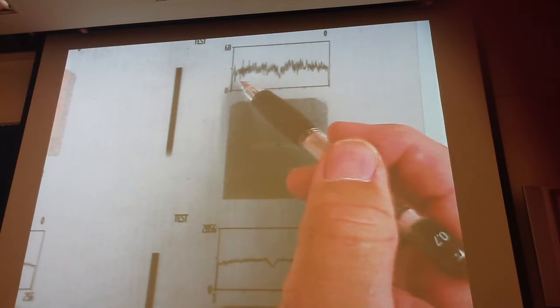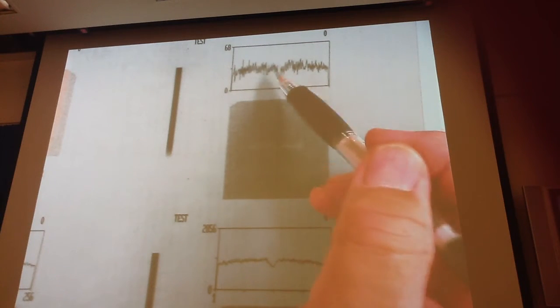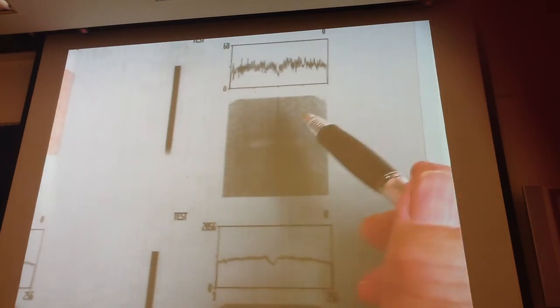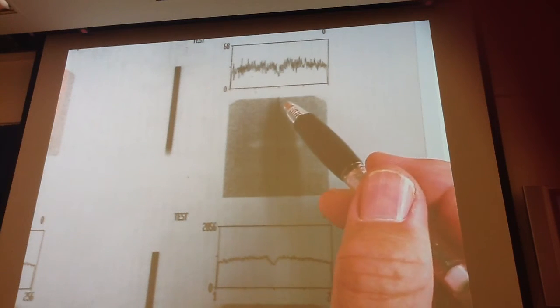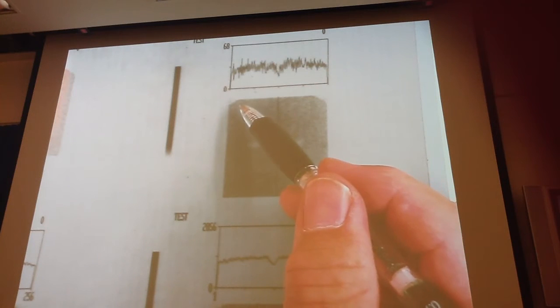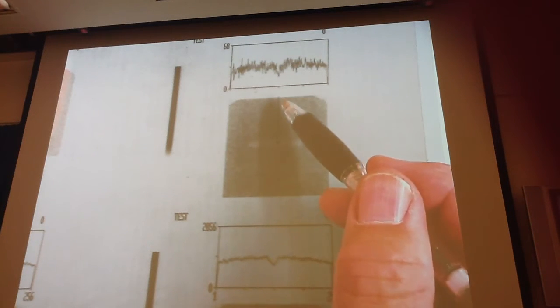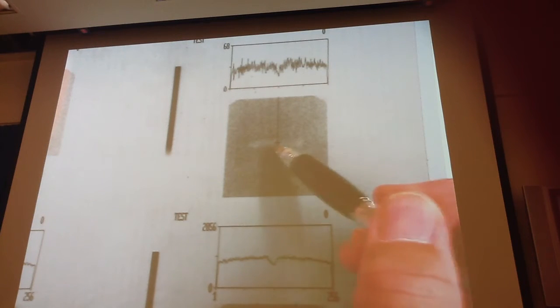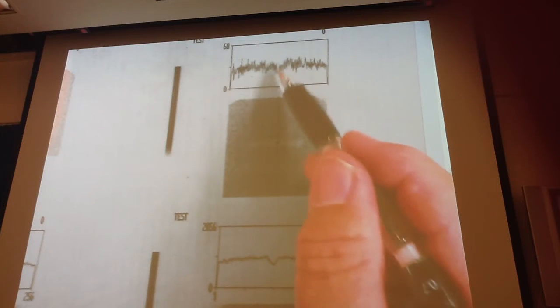Yeah, this is called Fourier transform. Okay, this is what a noisy image looks like. There's 64 pixels here, 64 going in the vertical, and 64 going in the horizontal. I just told the computer to look at this row of pixels that are passing through my object. This is my object here.